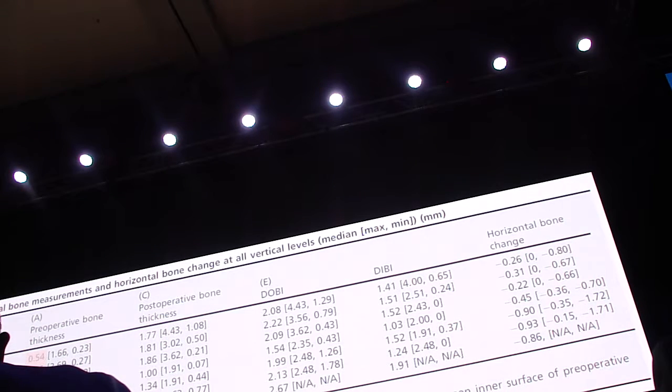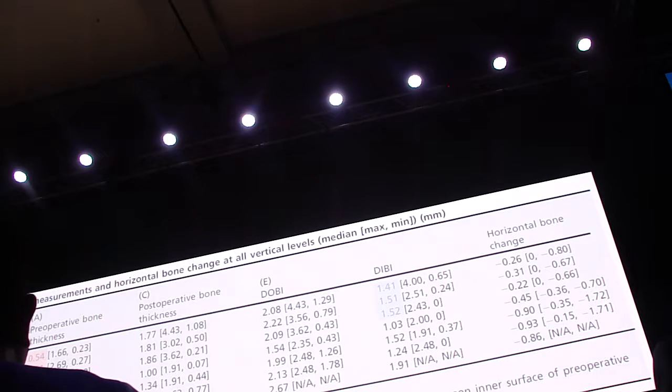We're talking about maxillary anterior implants. That's what we kind of expect. It can go down to 0.3, but 0.5 is a reasonable number. So the bone has a remaining thickness of 0.5. Now, the DB, this is the jumping distance in these 12 patients. It's 1.5. 1.5, the magic number in dentistry. Every time you ask about numbers, say 1.5 and then you're safe, okay? 1.5, the jumping distance in these 12 implants.